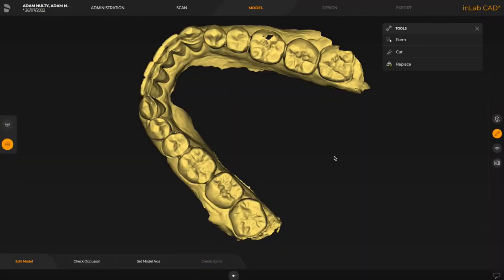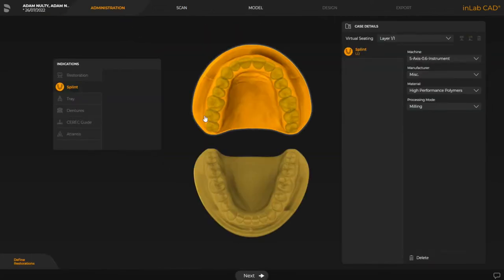Hi everybody. In this tutorial I'm going to show you how you can take your imported STLs that are in in-lab into in-lab splint and designer splint. If you remember in the previous tutorial we showed you how you can set the administration phase to be able to select a splint first and then select whichever arch you're going to be providing it for.